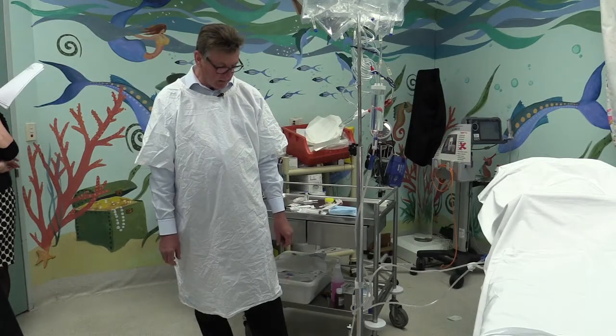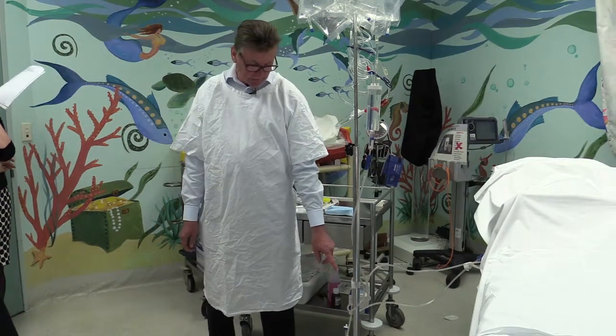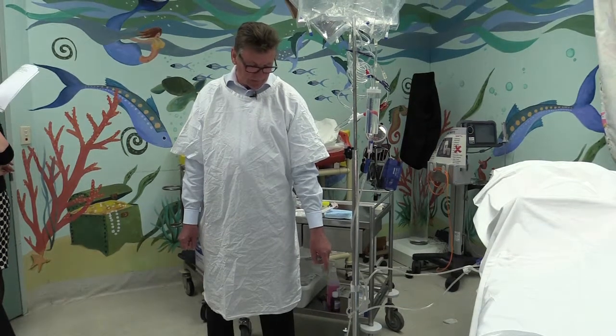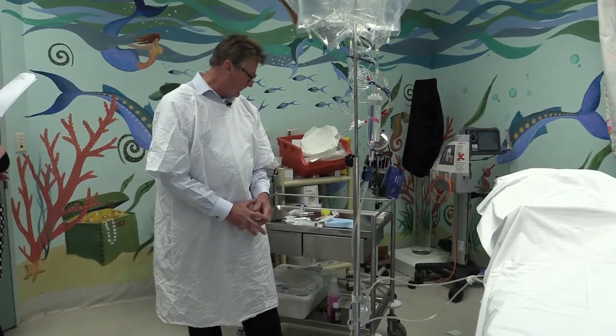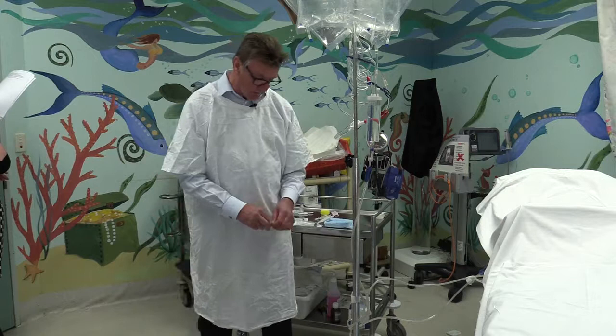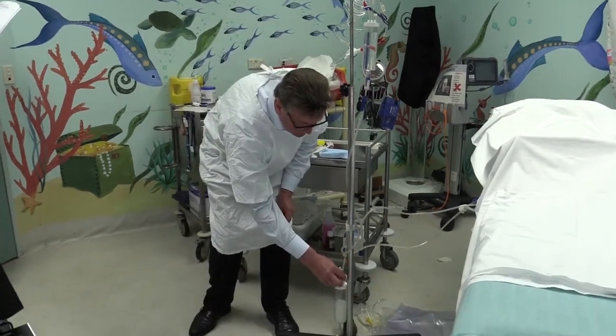Prior to sampling the turbid fluid, to send for hopefully gram stain and cell count, we do a 1-minute hand wash, and open up the necessary packs, and place an alcohol swab on the sampling port.